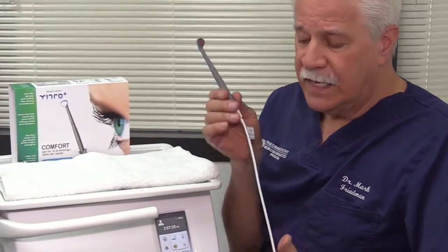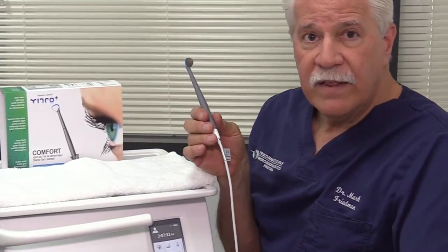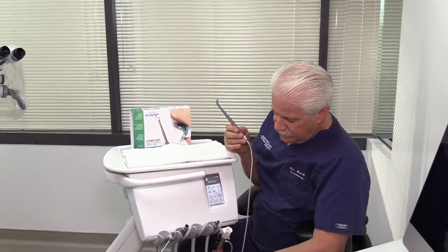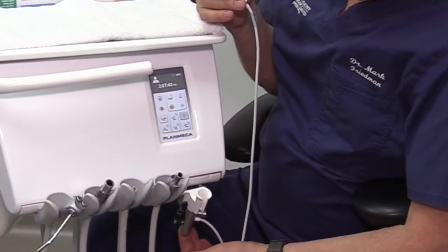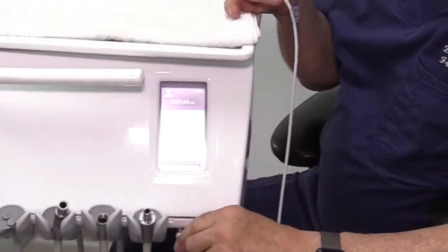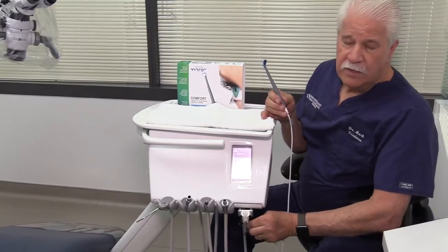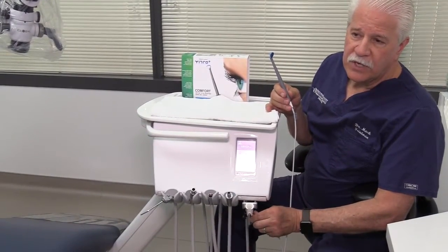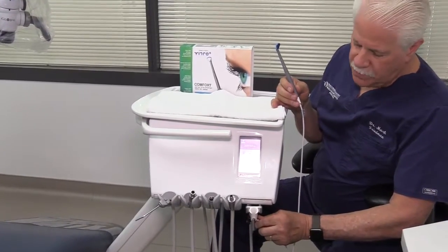Air pressure comes out of the tubing once you activate the on switch for the air port. There's a switch at the bottom that activates the air pressure, and once that switch is activated, you have an adjustment to control air pressure — so you can have minimum pressure or a lot of pressure, depending on whether you're creating a large spray or minimum water spray.